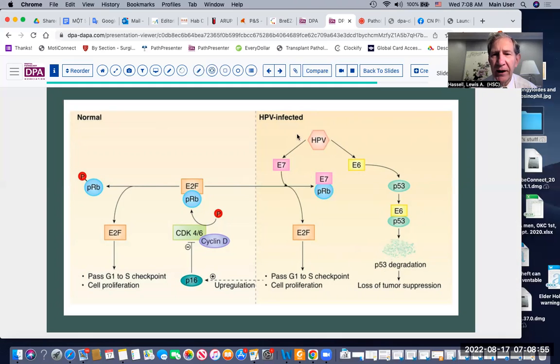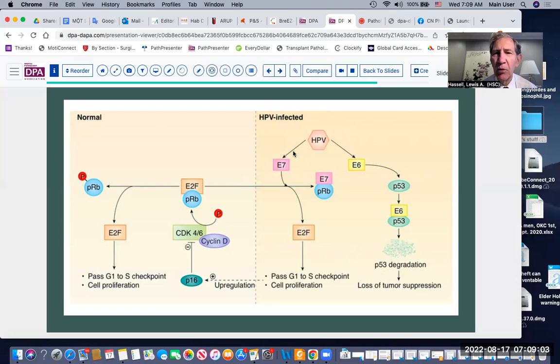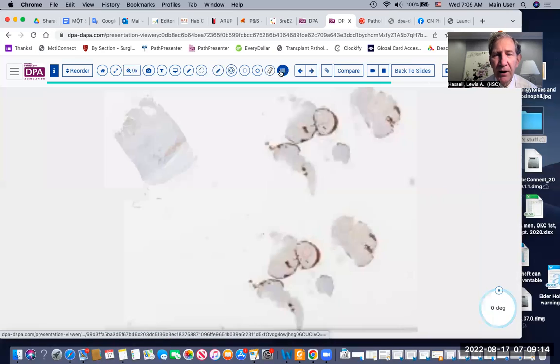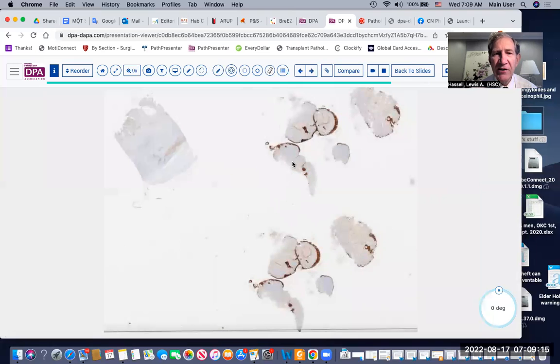HPV is only one mechanism that can activate these proteins. With serous carcinomas, a different mechanism leads to positive feedback and upregulation of P16. Let's look at a couple of real-life cases here.